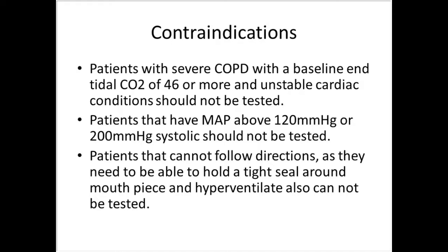And this is why it's important to remember that CO2 will maximally dilate the microcirculation, and blood pressure will increase to compensate for that dilation. So you don't want your patient to start off hypertensive, and that's why we have these guidelines in place.